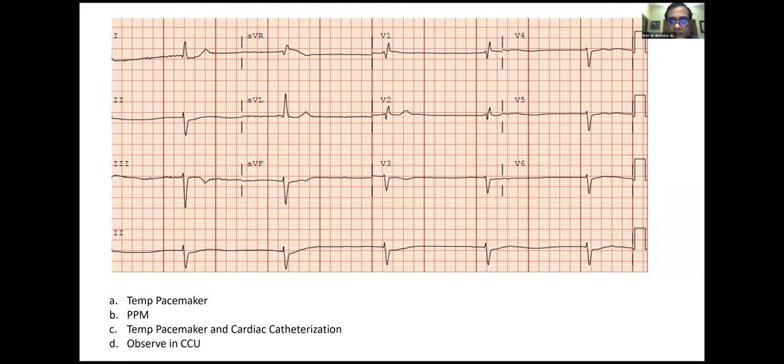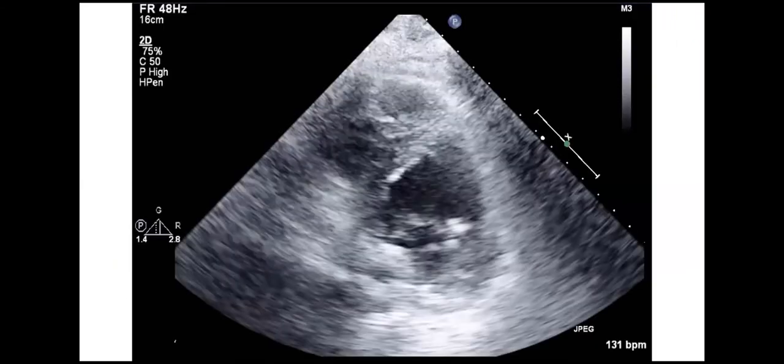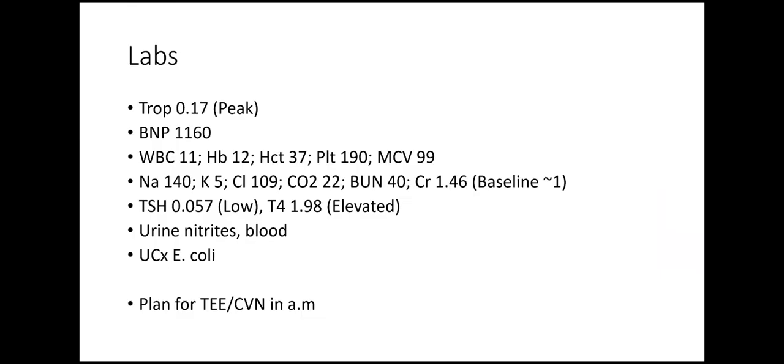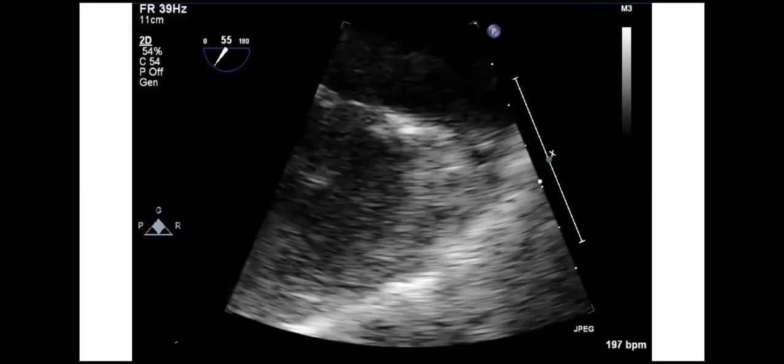The atrial fibrillation. And then we have to give beta blocker in future. So I think she requires a permanent pacemaker as well. Remember, this was his initial EKG in the other hospital, with the AFib, right bundle, left axis. So she has bifascicular block from before. Now, with the medications, it has gotten worse.